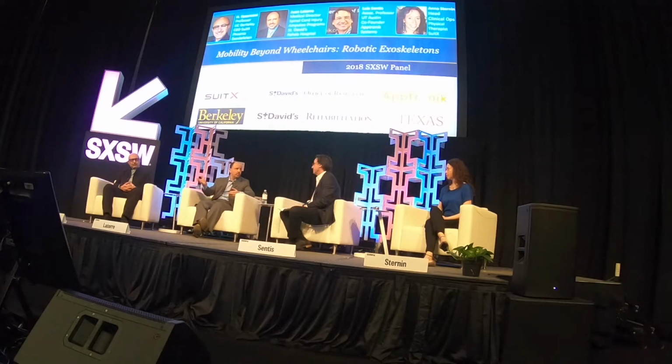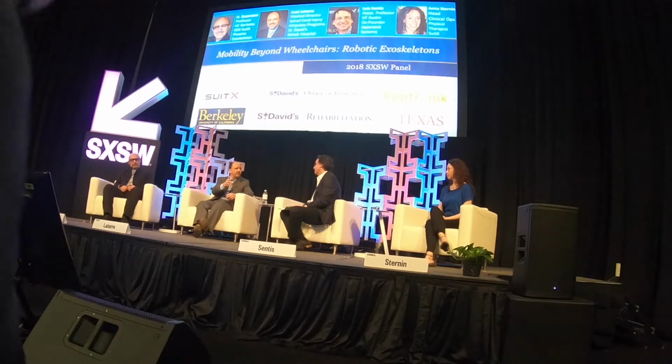Dr. Kazerooni mentioned cerebral palsy. Cerebral palsy is the most prevalent cause of physical disability in childhood, happening in 2 to 3 kids out of 1,000. And the challenge with these kids with cerebral palsy is the crouch gait, and they can develop spasticity and contractures and problems. So if we can institute this technology early on, you could argue that you can potentially prevent some of these complications we see in cerebral palsy. Patients with spina bifida, same thing. The challenge with the pediatric population is that the devices need to accommodate their body, and as they grow, you need to have some adjustability that can accommodate a growing skeleton.